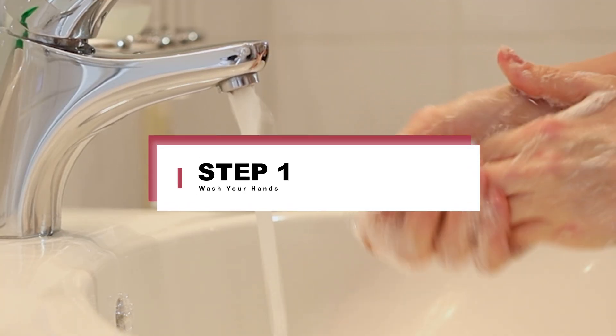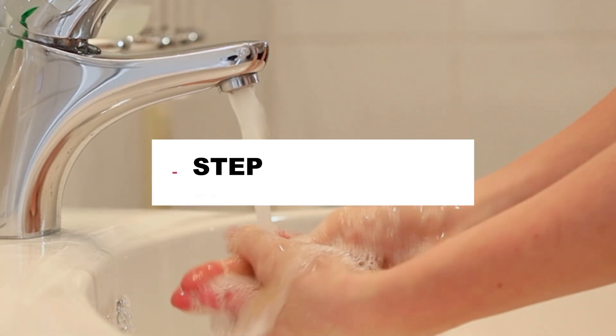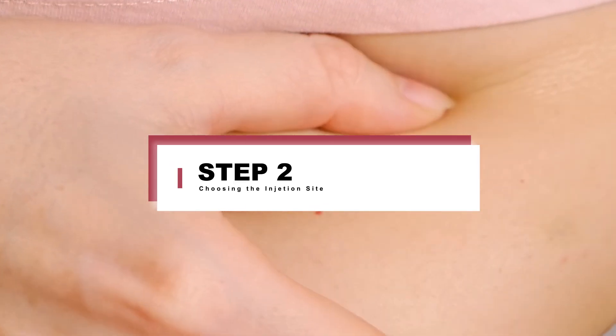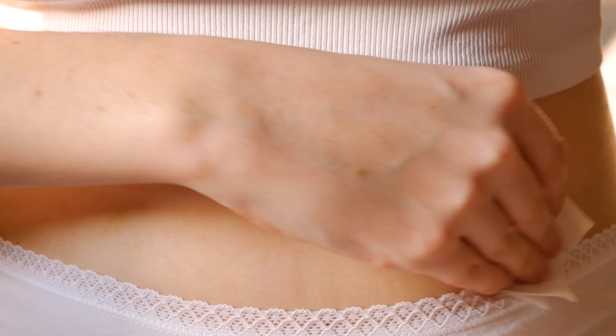Step 1: Wash your hands with soap and water. Step 2: Choosing the Injection Site. The most common injection site is the lower abdomen, at least one inch away from the belly button.